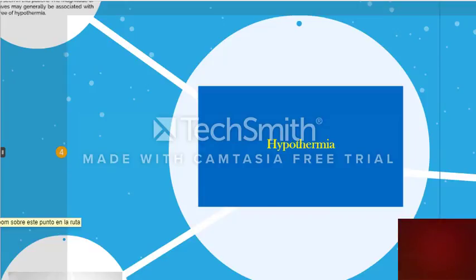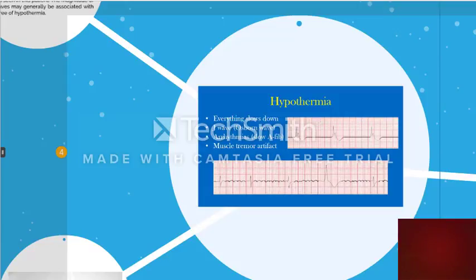In this lecture, we will discuss the EKG changes that can be seen in hypothermia. Hypothermia can produce several EKG changes as an individual's body temperature drops below 30 degrees Celsius. First, everything slows down at cooler temperatures. Sinus bradycardia is common, and all the segments and intervals, including PR, QRS, and QT, may become prolonged. It's as if the cardiac cycle is being stretched out. So again, first thing, everything slows down.